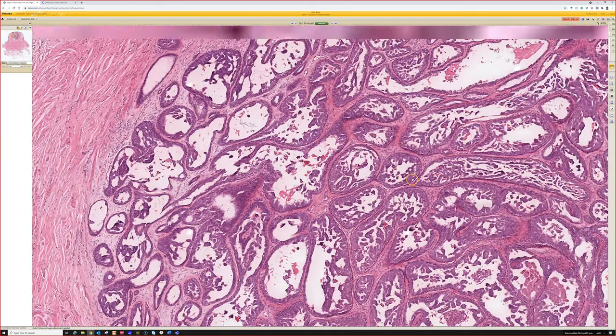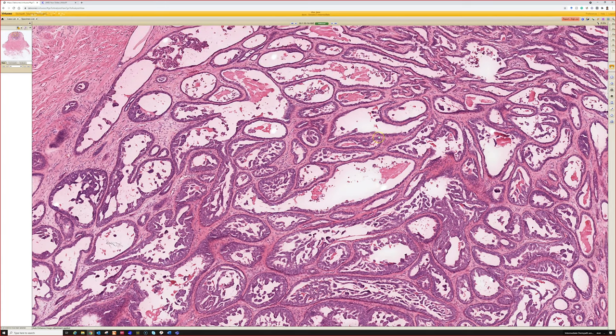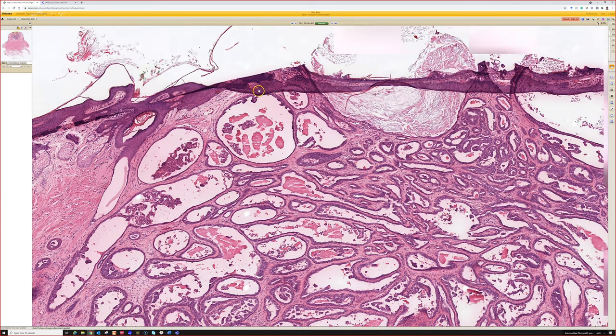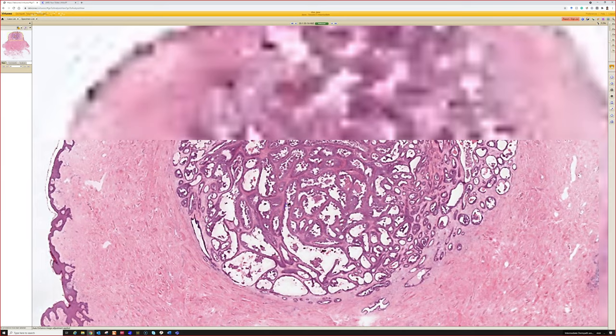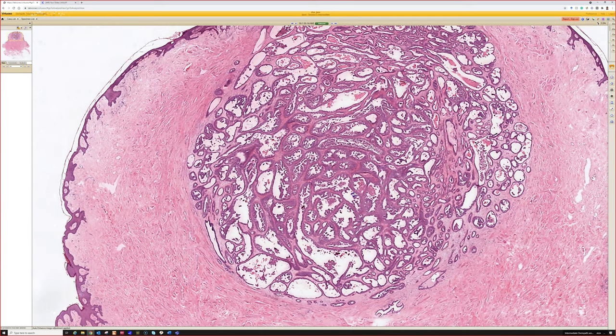And if you're a pathologist, I think there's a lot of overlap microscopically. I'm not a breast pathologist by any means, but to my eye, these have a lot of overlap with usual ductal hyperplasia of the breast, UDH, or ductal papilloma of the breast. So honestly, I don't see them very often. If I see a biopsy where I can't see the whole thing, like here you can tell this is obviously limited to the dermis in the nipple. This is definitely a nipple papilloma and is benign.